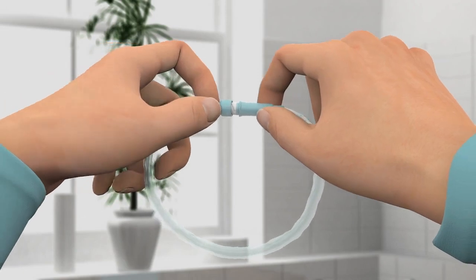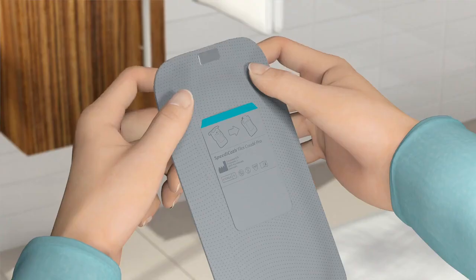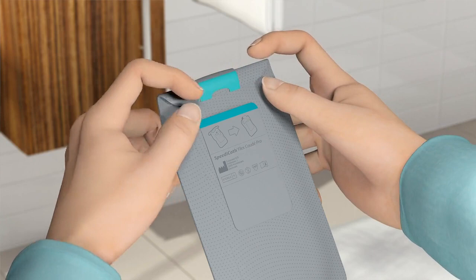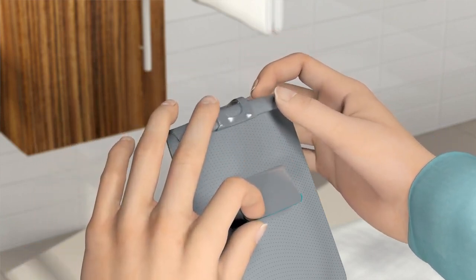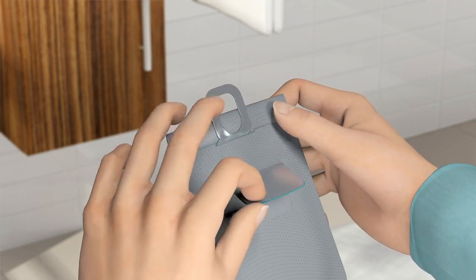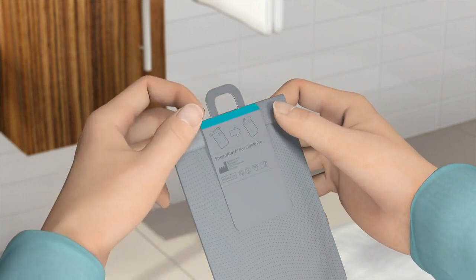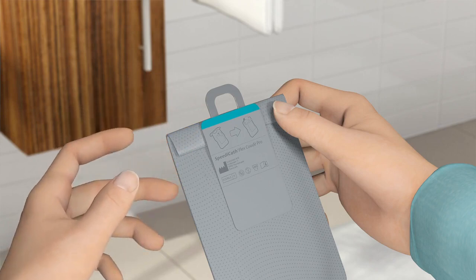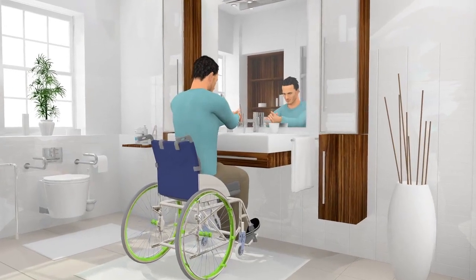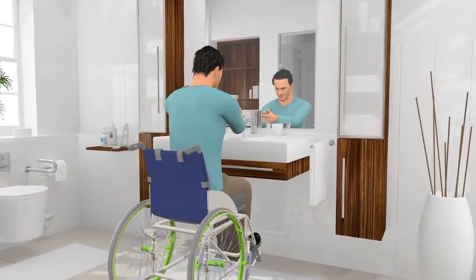Twist the lock to seal the catheter. Then put the catheter back into the packaging and close it by folding the flaps and sealing with the sticker. You can dispose of the catheter and the packaging in your household rubbish. Do not flush it down the toilet. Wash your hands, and you have completed the process.